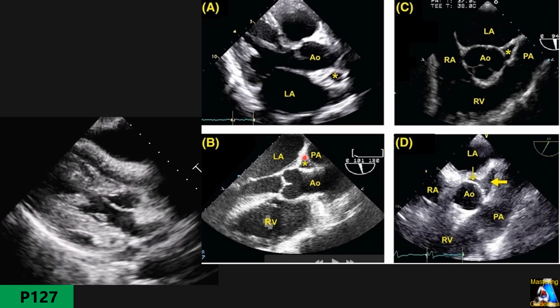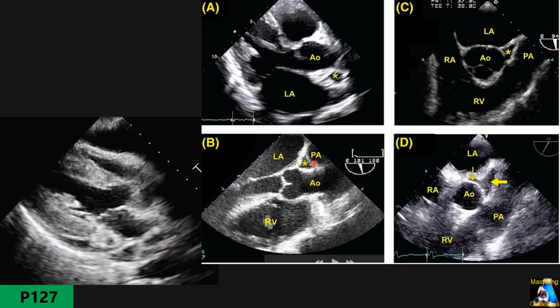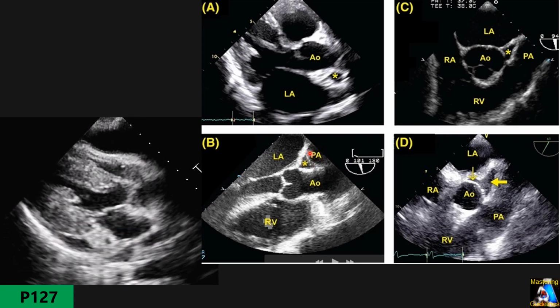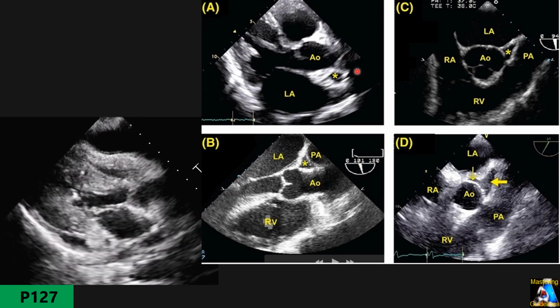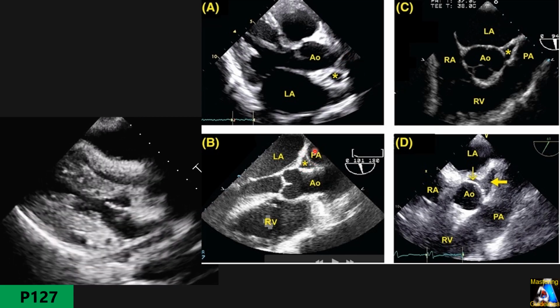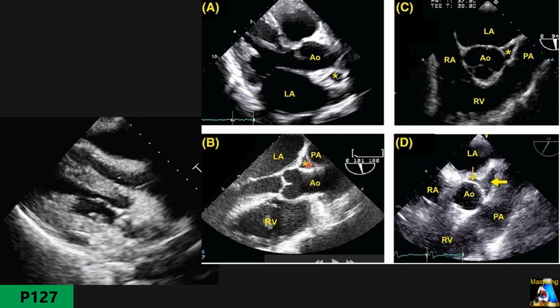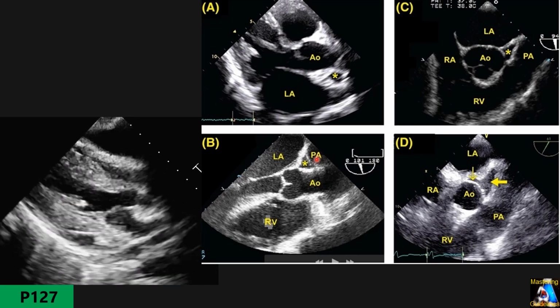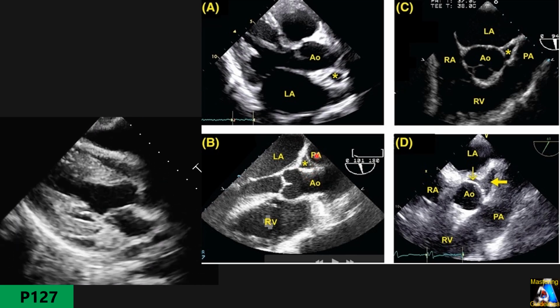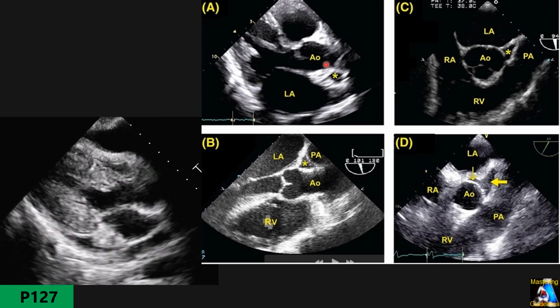Here it is more clear, it is a triangle. This is the transverse sinus, and above that is the pulmonary artery, the right pulmonary artery. So how can you differentiate the pulmonary artery from the transverse sinus? With the heart activity, the sinus shape changes, the pulmonary artery shape doesn't change. And if you put color, you can see the Doppler color on that is completely different.